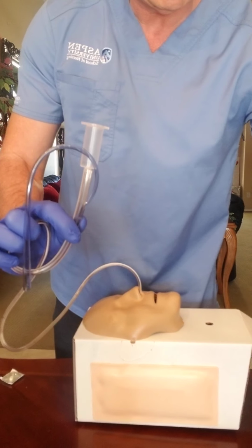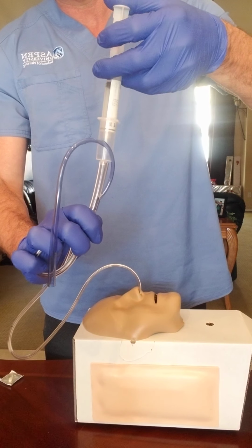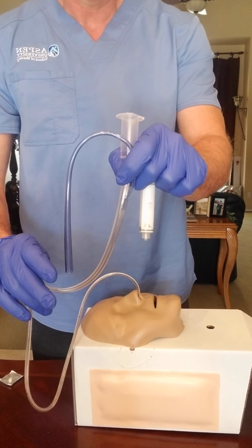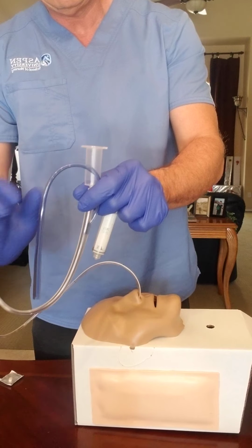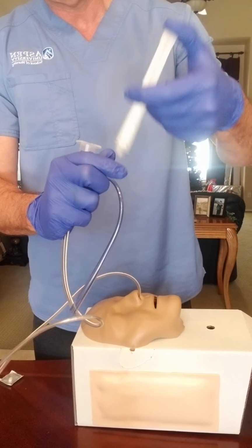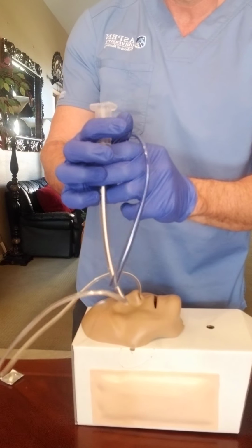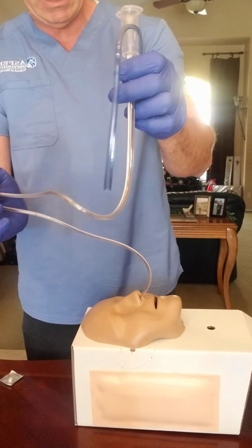I'll pour my next medication and do 10 ml of water in my big syringe, control the flow nice and slow, and then when it's all done, I'm going to pour again another 10 ml of saline, control the flow, hold this up high so the gravity takes place.